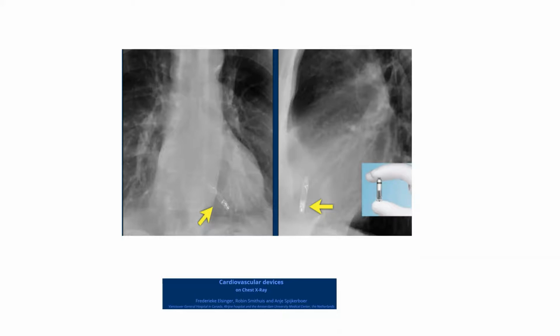But you know, the technology is advancing, and I knew from my colleagues in EP that there is a device that now is equipped with Bluetooth, so it can interrogate the atrial. Sorry.